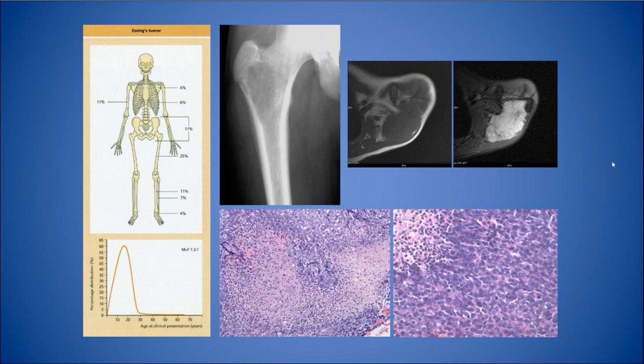The histomorphological characteristics of Ewing sarcoma are monotonous proliferation of small round blue cells with relatively uniform nuclei, scant cytoplasm that can be pale pink to clear, and it is not uncommon to see areas of geographic necrosis and scattered mitotic activity.